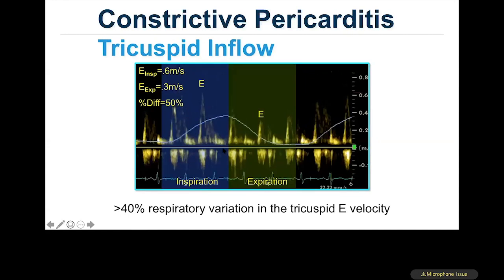On the transtricuspid side, comparing the E-wave after the beginning of the first inspiratory cycle versus the first expiratory cycle shows a change from 0.6 to 0.3 m/s — a 50% or greater change in transtricuspid inflow peak E velocity. A change of more than 40% in tricuspid E velocity allows diagnosis of findings consistent with constrictive pericarditis.